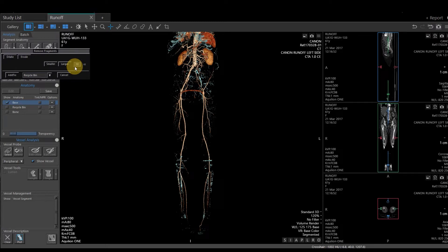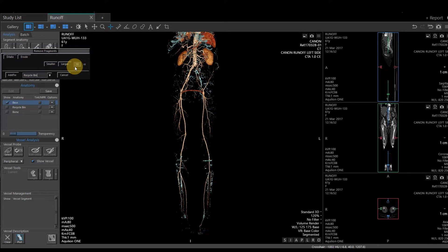One thing to keep in mind when doing the runoff application is sometimes people with peripheral vascular disease have little breaks in the lower legs or the lower legs don't fill as well. So sometimes you can hit Remove Fragments, and it will cut off specific vessels that you don't want removed.